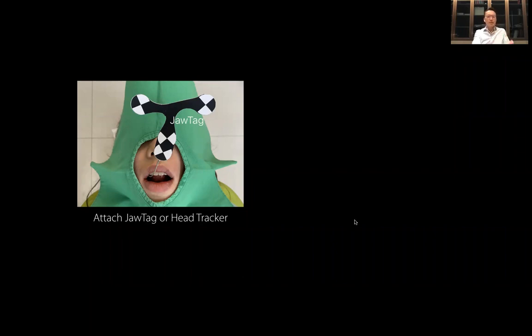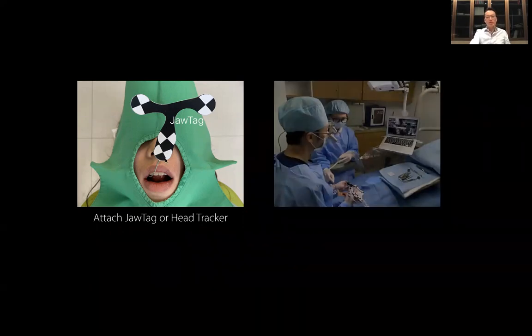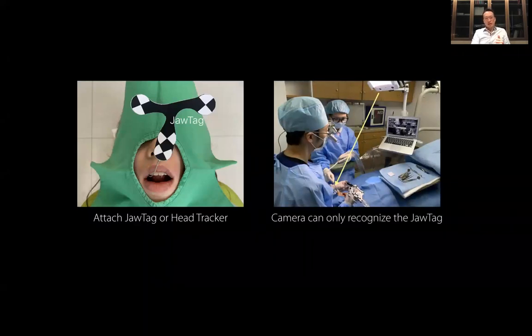There is also another device called the head tracker. It works like a helmet the patient wears on his head, and this is for working on the maxilla. Basically, we need to attach this device with the checkerboard-like pattern onto the patient's physical anatomical structure. One thing I thought was interesting is that the camera doesn't see any of the patient's physical structures, like teeth or bone. The only thing the camera can see and recognize is this jaw tag, or this device with a checkerboard pattern.